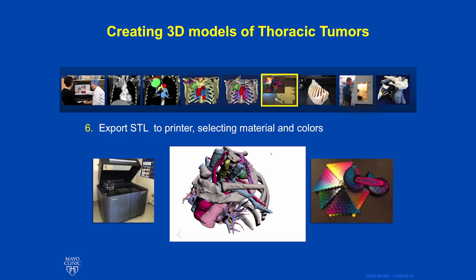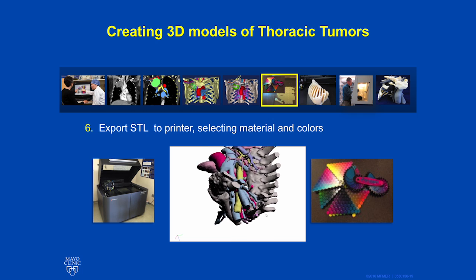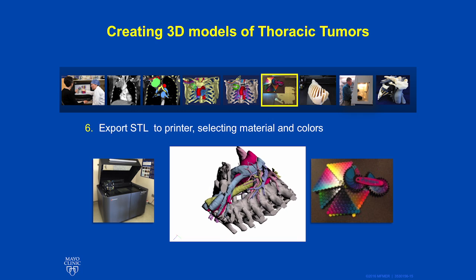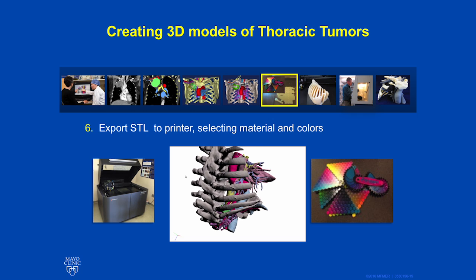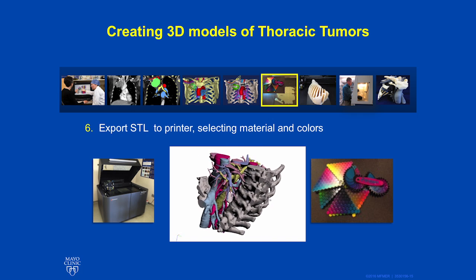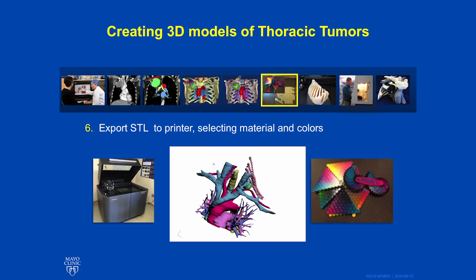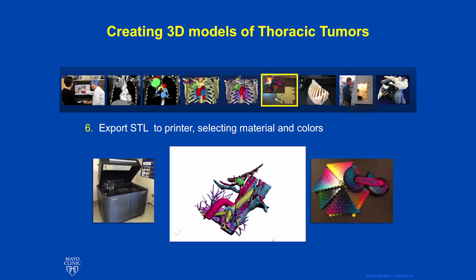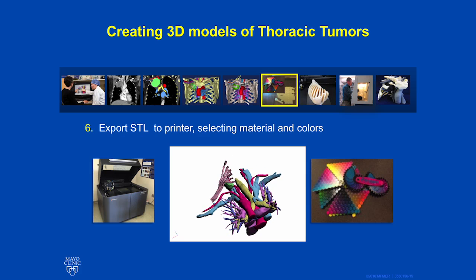It is during this process that we use programs that allow for smoothing, which does constitute losing some detail but makes the image appear more like an organ, essentially reducing the pixelation of the 3D image. We can also use wrapping, which refines the image. When we have tiny, small, fine structures, you may not want to use too much smoothing or wrapping. However, when creating large structures like a diaphragm or the surface of a lung, one may want to use more smoothing to create an image that looks more like an organ.